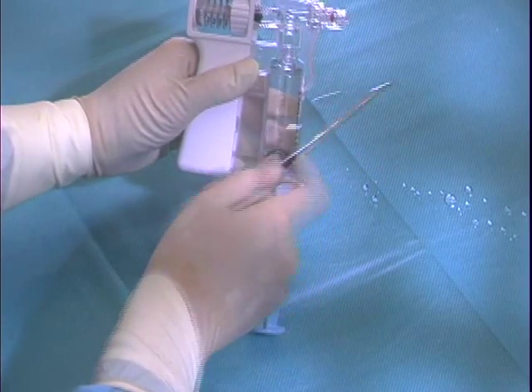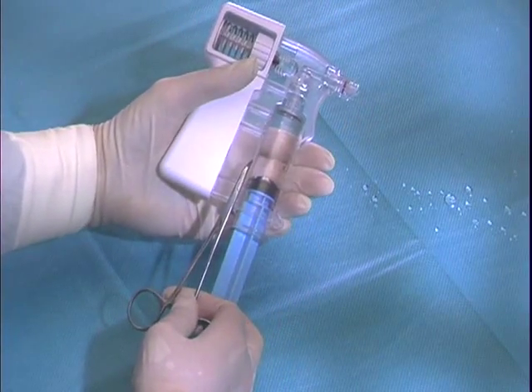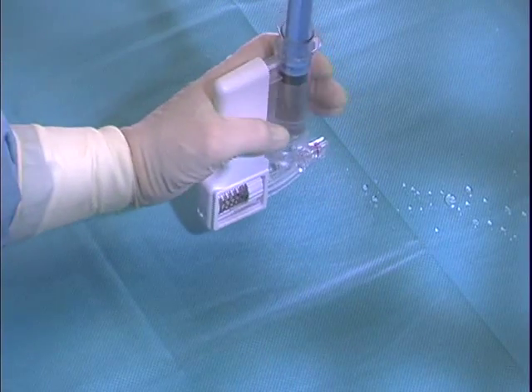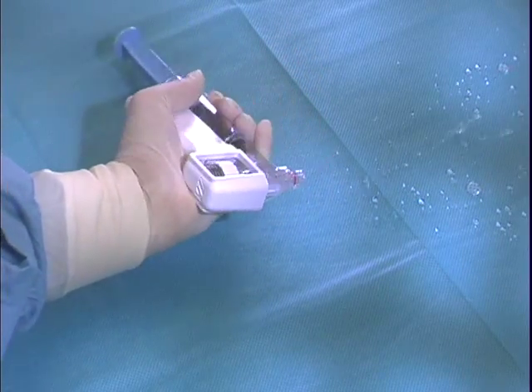This may include tapping the Squirt fluid path with a hemostat or similar device to dislodge any air bubbles that may be present in the system. The Squirt can be rotated during flushing to ensure that all air is displaced from the device prior to connecting to the Fountain catheter.